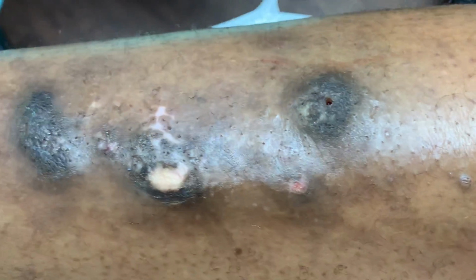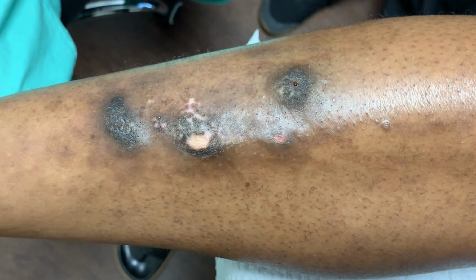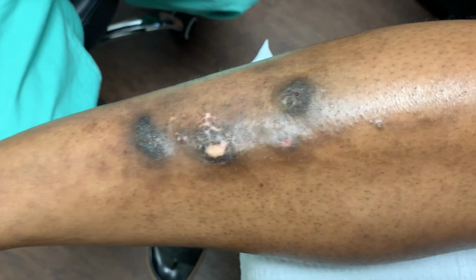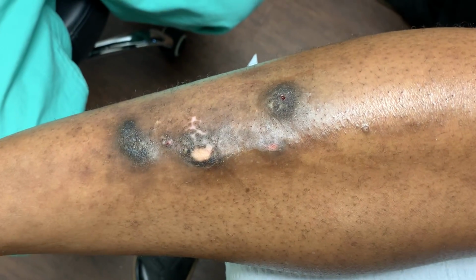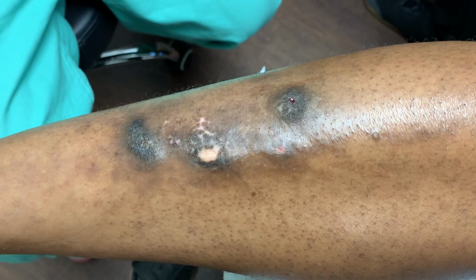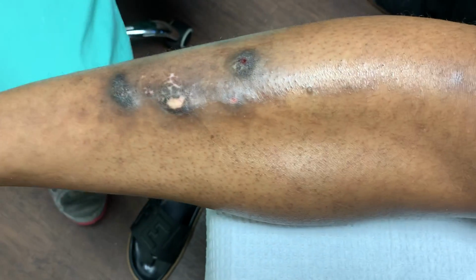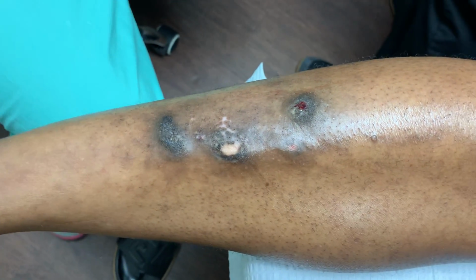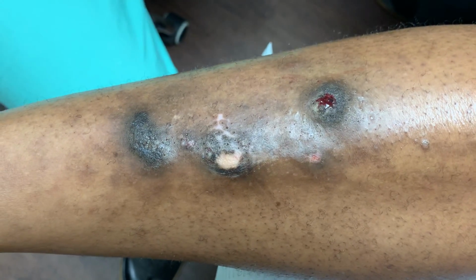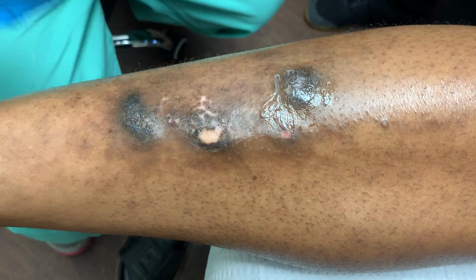Epinephrine constricts. It doesn't allow the vessels to actually bleed. We only use lidocaine with epinephrine in this office when we do biopsies. We do not use lidocaine with epinephrine for anything else. It is a complete no-no. So what we're going to do is put a little bit of antibiotic cream, just like this. Very little. That's beautiful. A little dab there. And that's it.